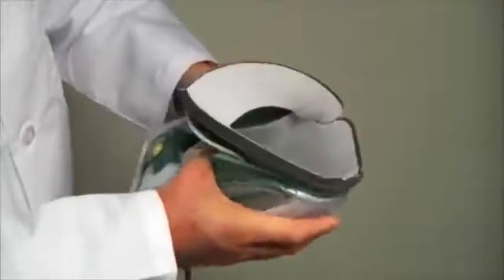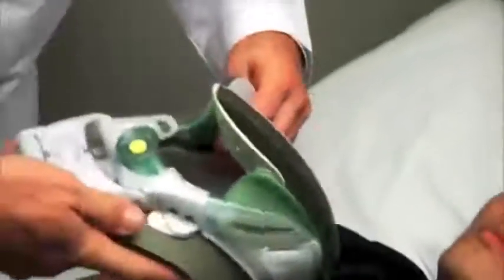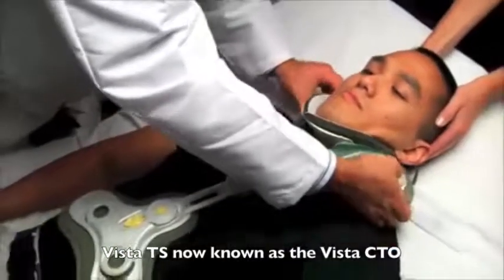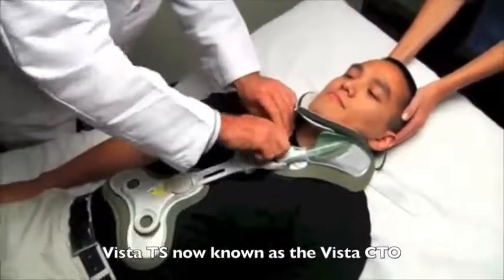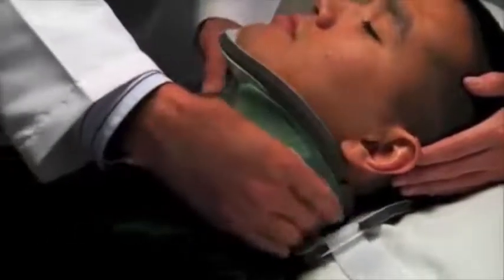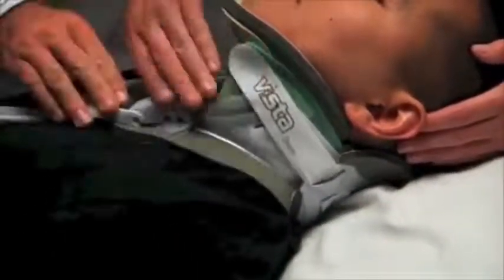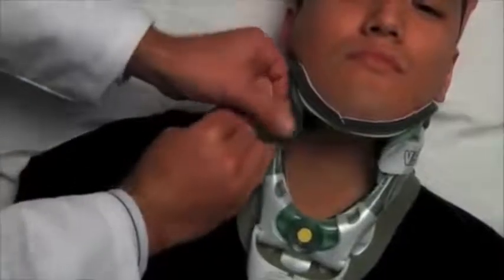Apply and adjust the Vista collar onto the patient. If you can apply the Vista collar, then you can apply the Vista TS. Gently pull the dial outward to unlock and then turn clockwise to dial up until the foam pad on the chin begins to compress. While holding the front panel in place, attach the loop strap from the back panel on both sides. Anchor your fingers on the front panel and peel back and tighten the loop straps.